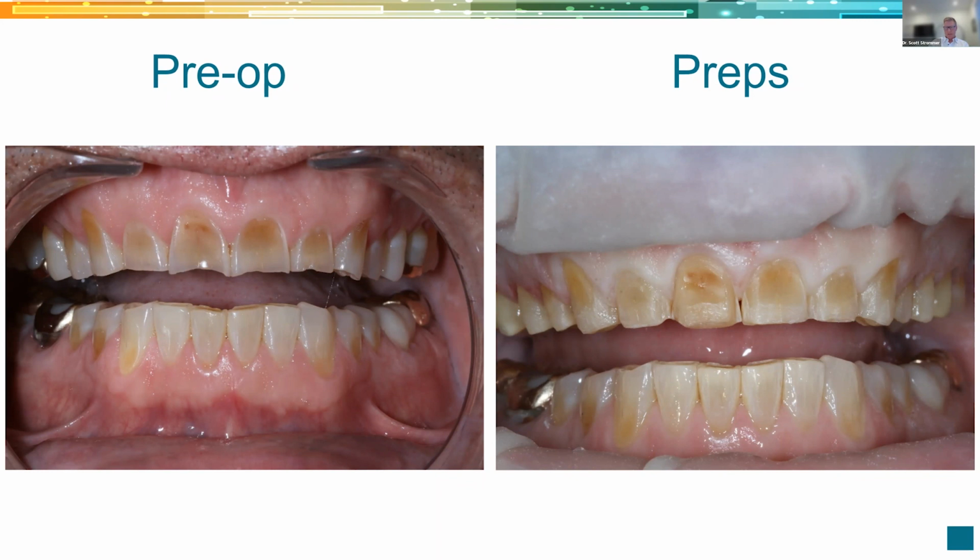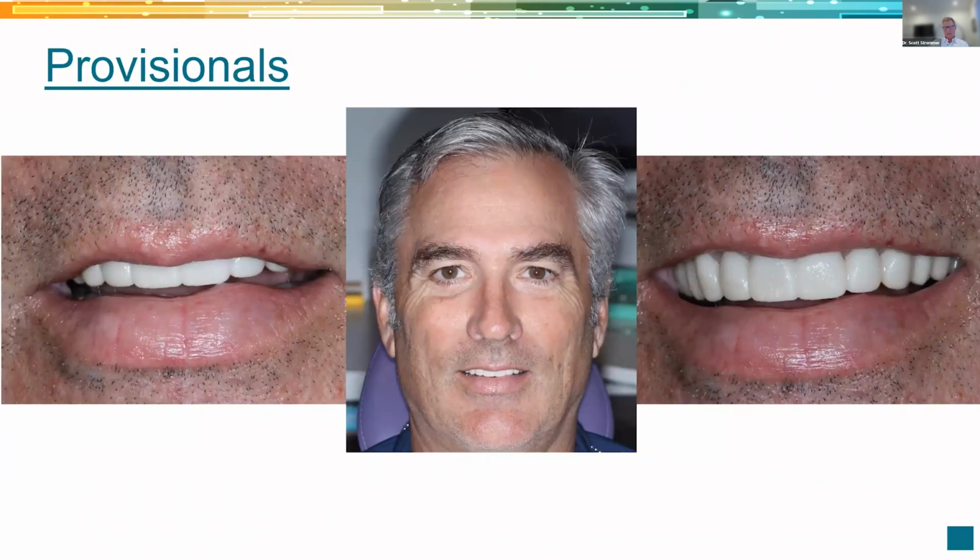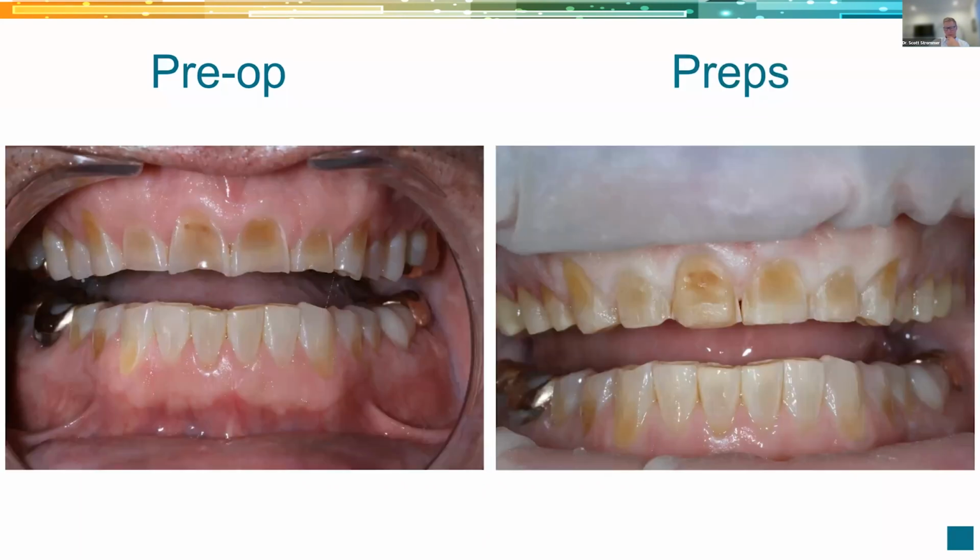Those of you that do these, I love seeing the fact that I get to save all that tooth structure. You can see some of the enamel still in place. He's already breached the enamel due to that abrasion and some of his other issues, his GERD and acid reflux, other things that are going on. But it's nice to check and see these things. Everything's tracking.